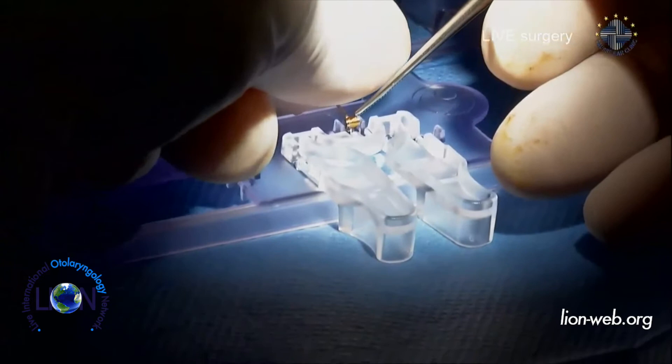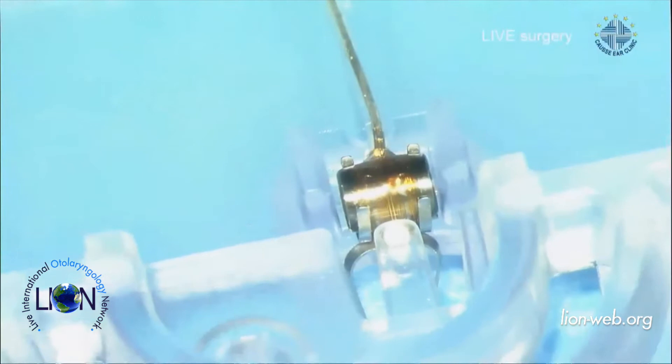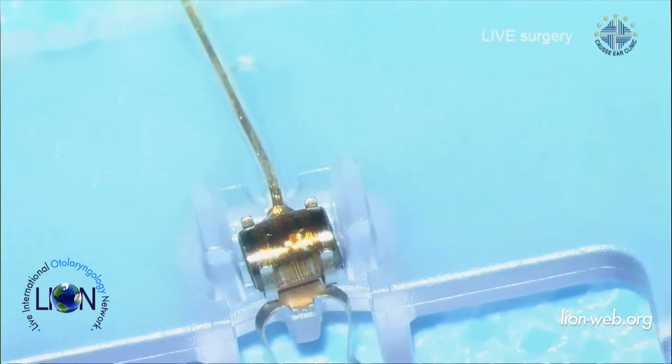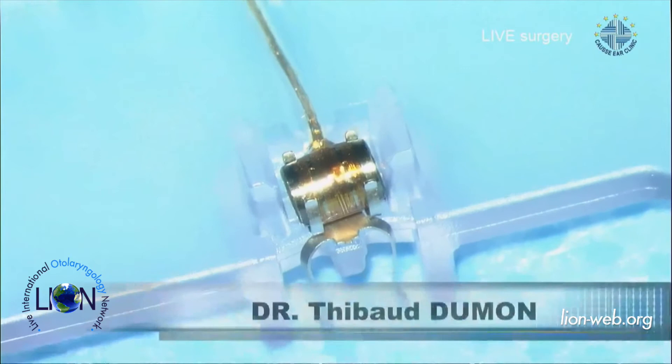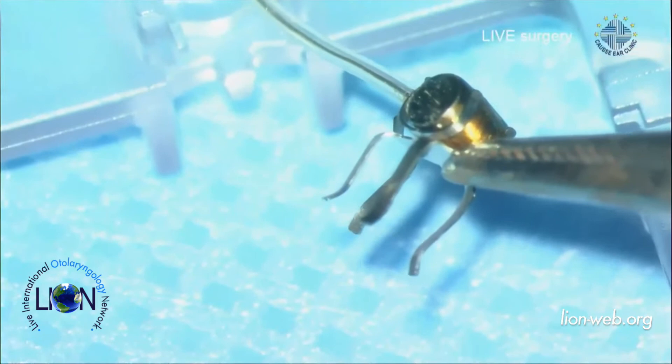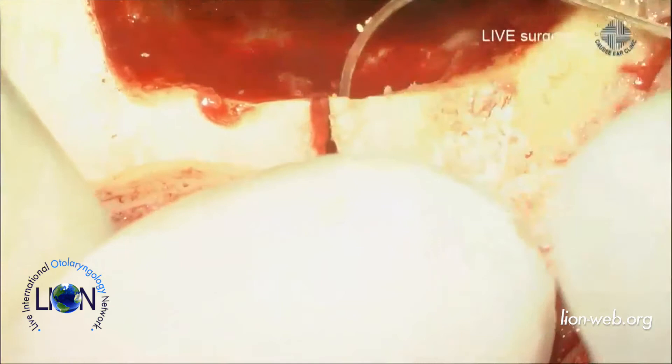The FMT is now fitted into the coupler — you can see it. I will now remove the coupler holder. Here is the coupler for the short process and body of the incus. Now I have to put it into the ear. The first step is to introduce the receiving antenna into the superior subperiosteal pocket, then push the conductor link under the bony bridge.